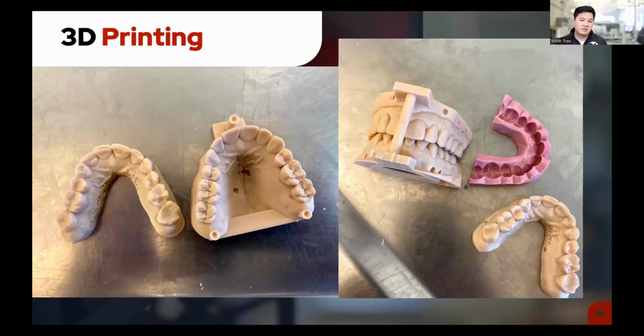I can do these in 20, 40 minutes. I know my library very well. I have a custom library that's very quick. It has very good average proportions that I'm very happy with, and I think it fits a lot of patients. So I use that library quite often. 40 minutes, I have it done.